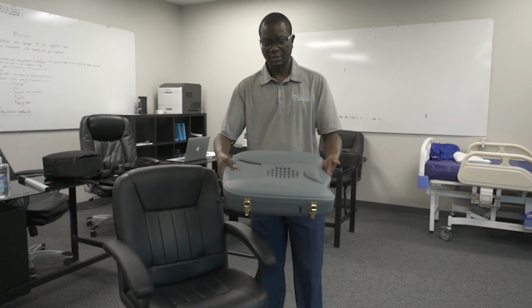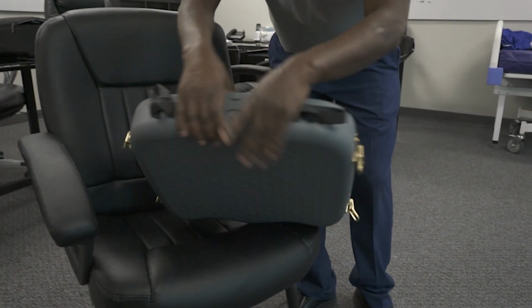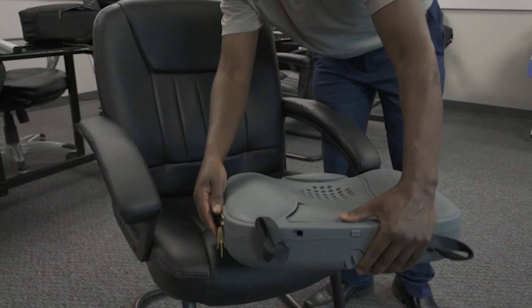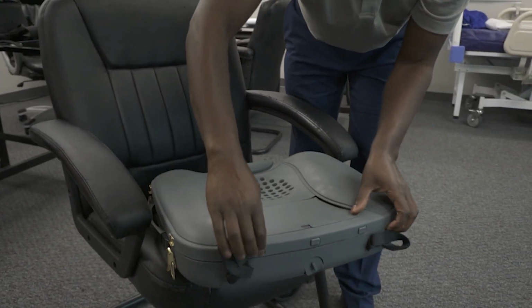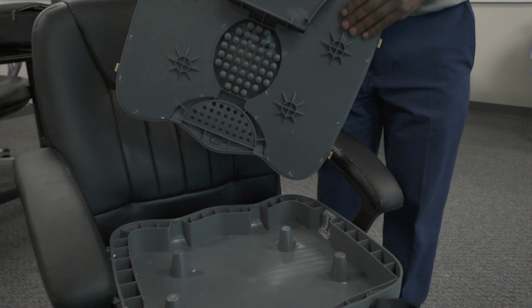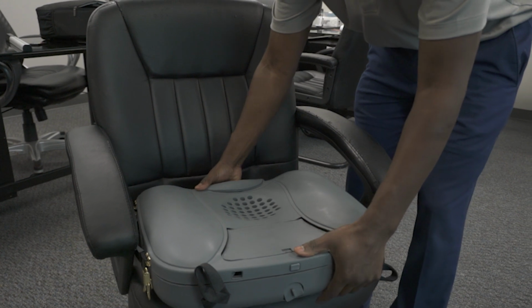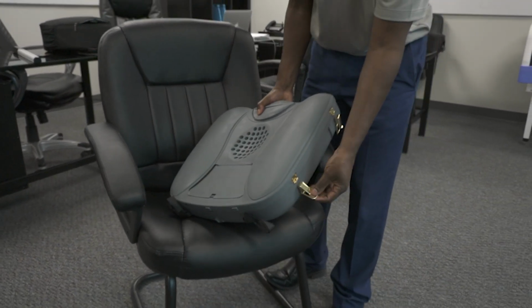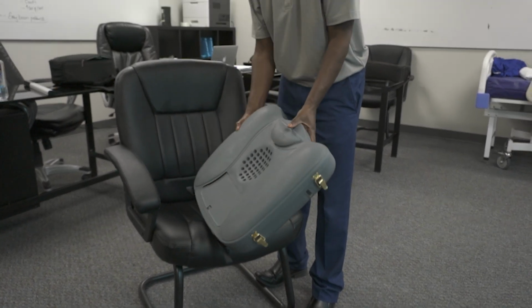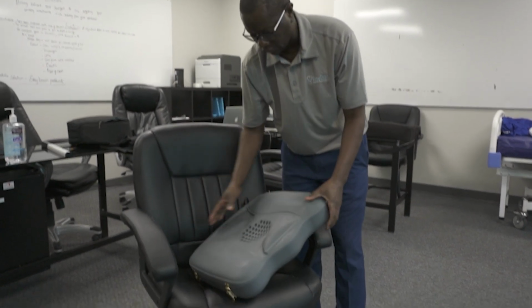It's also very easy to clean, actually. You just open the latches on the side like that. Once they are open, there are these two valves you push, and it opens up, and then you can wash it, and then just put it back. So it looks like it's made out of hard plastic. You can just hose it down with a water hose or something. Yes, you wash it with a water hose, and it remains clean, and it has a cushion right here, so you're not sitting on a hard surface.